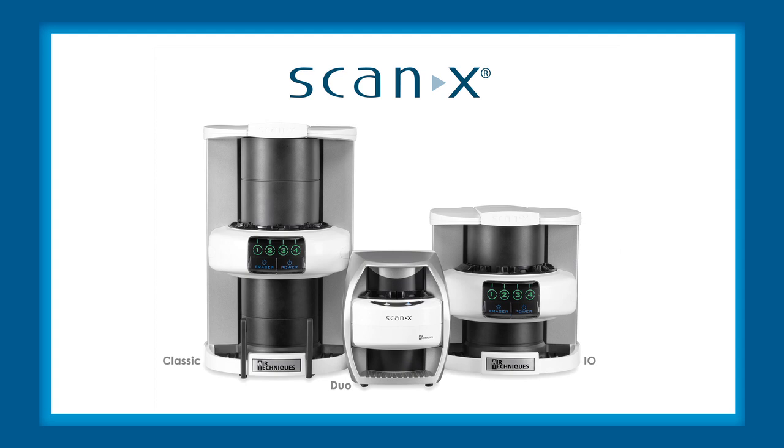While we'll be using ScanX Classic for our demonstration, everything you see will apply to ScanX I.O. and ScanX Duo.